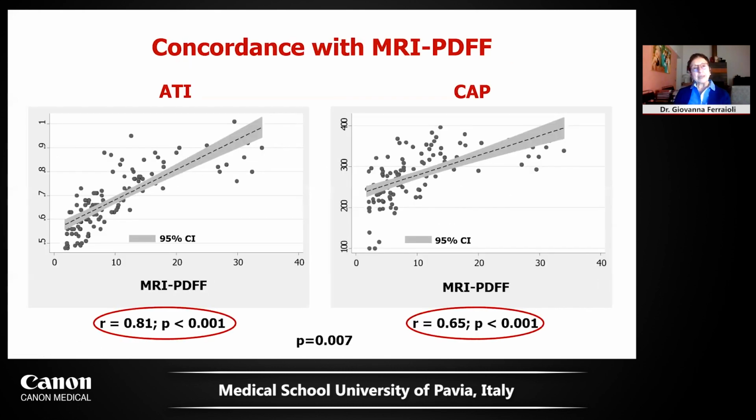And when we assess the concordance with the PDFF, the concordance of ATI was significantly higher than the concordance of the controlled attenuation parameter.